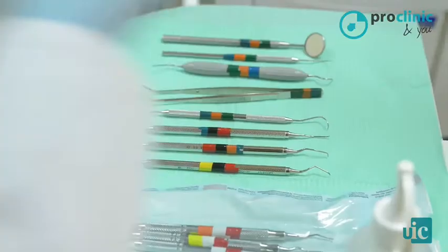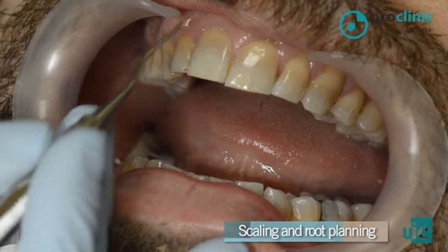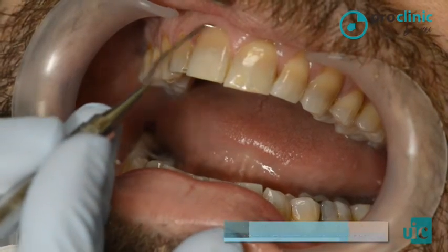Scaling and root planing is included in phase 1 of the periodontal treatment. The aim of this phase is to mechanically remove supra and subgingival deposits, as well as to smooth the root surface. By scaling and root planing, we can eliminate supra and subgingival deposits mechanically.